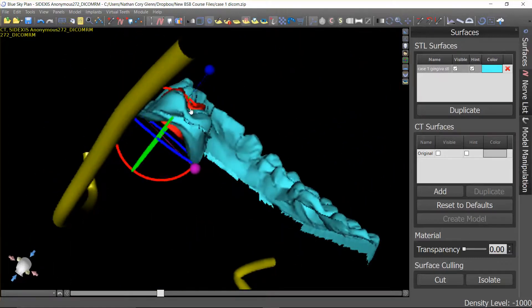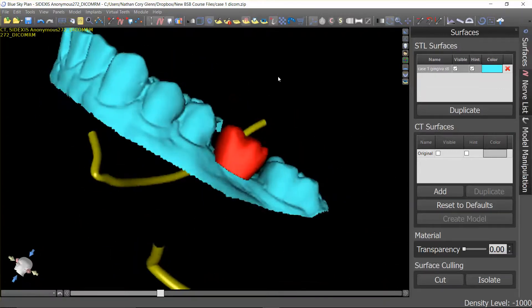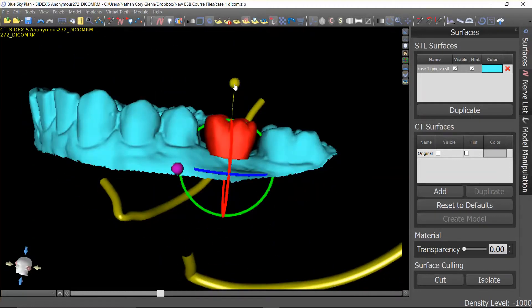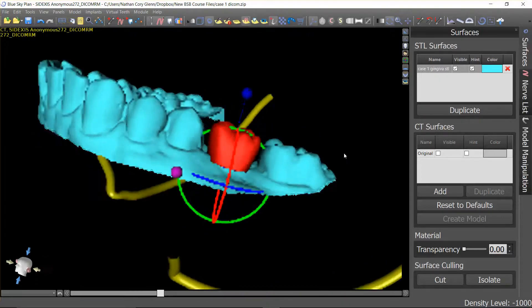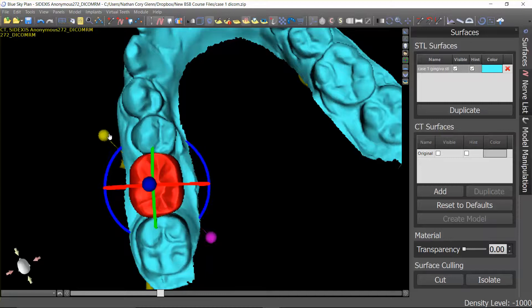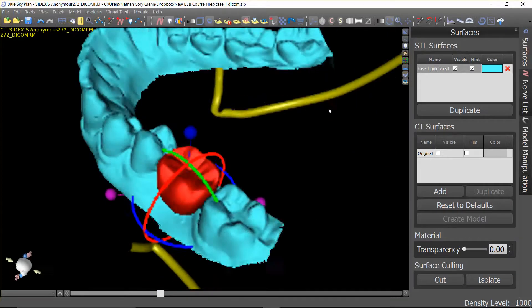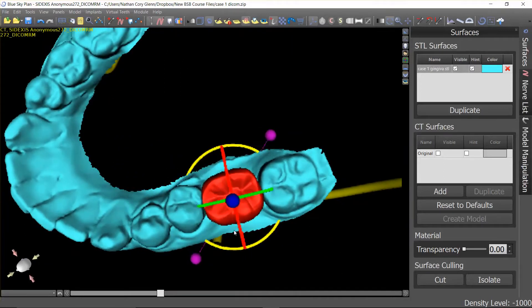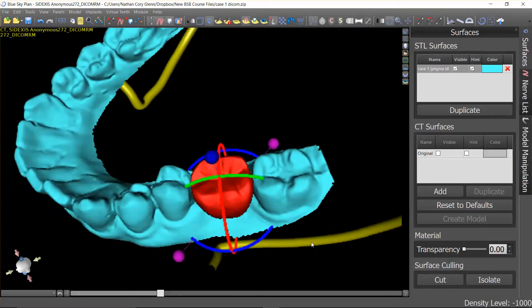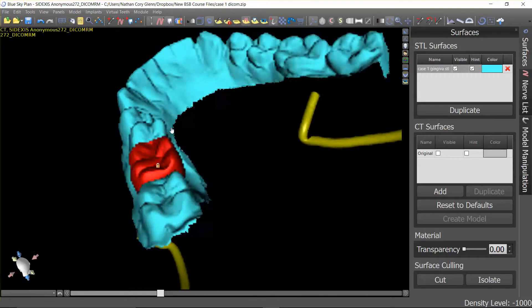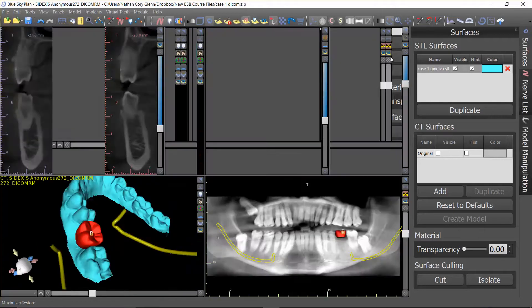You've also got the ability to stretch the tooth to make it fit the space more appropriately. Looking from the vertical axis, you can grab a handle and stretch it up or down to make the tooth taller or flatter. Looking from the occlusal view and hovering, you'll see pink rings — grab those and pull outward to stretch the tooth mesio-distally. The tooth looks like it's in the appropriate position in the arch. Once you like the tooth position, right-click on the tooth and lock it, because if you don't lock it you'll accidentally grab one of those rotation rings and knock it out of position.